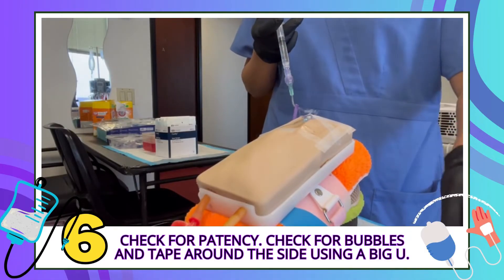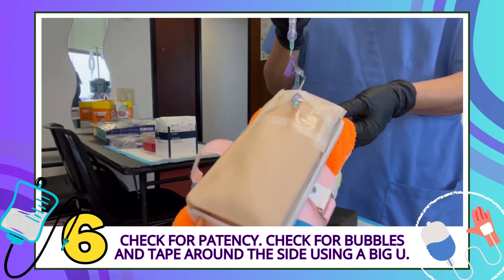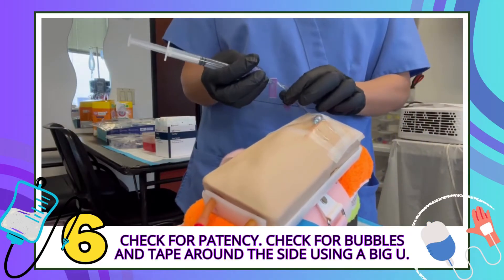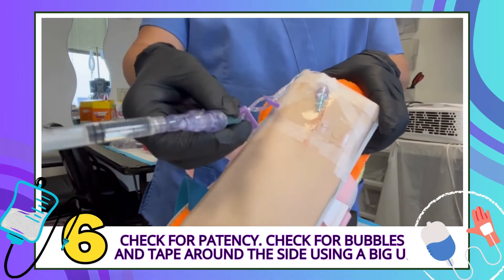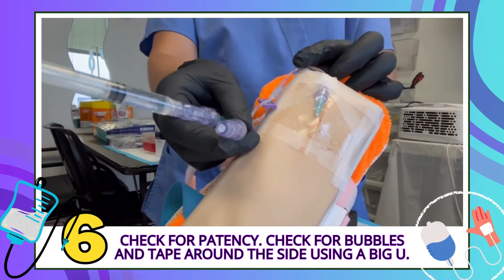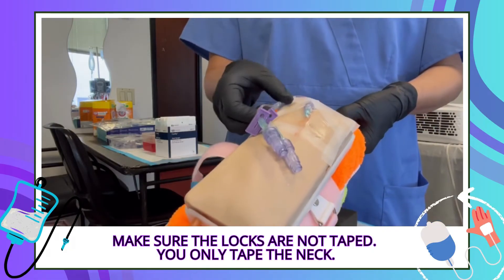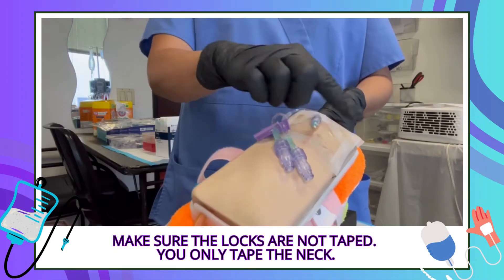Whenever we tape, we want to check for patency — is it flushing well? Check for bubbles. If it's flushing well, that means you taped correctly without occlusion. We also got to stabilize the double lumen double-port hep lock. Instead of a sharp U, you want a nice big U. Make sure the locks are not taped and you don't tape the ports — you only tape the neck. I'm going to show you how to tape it without covering the window.